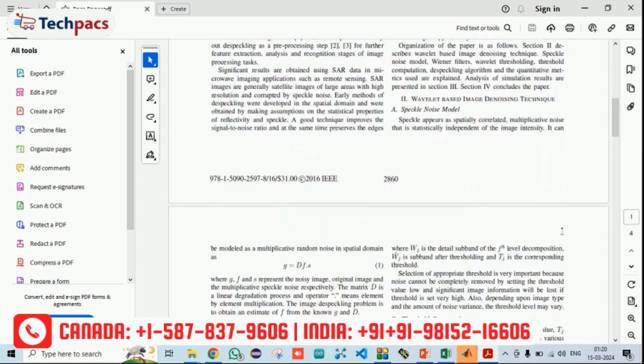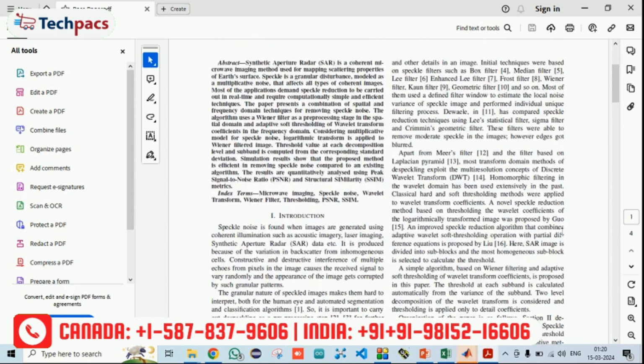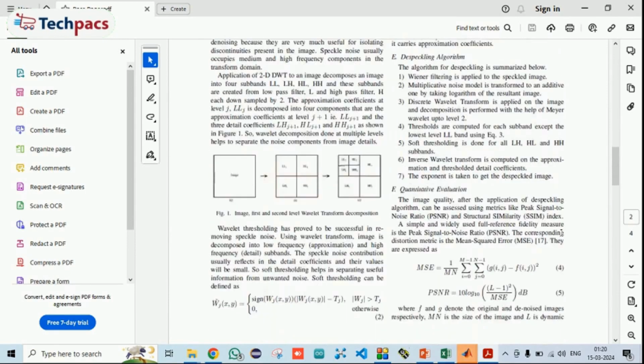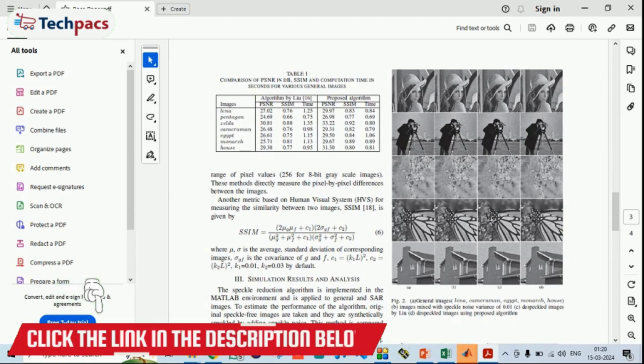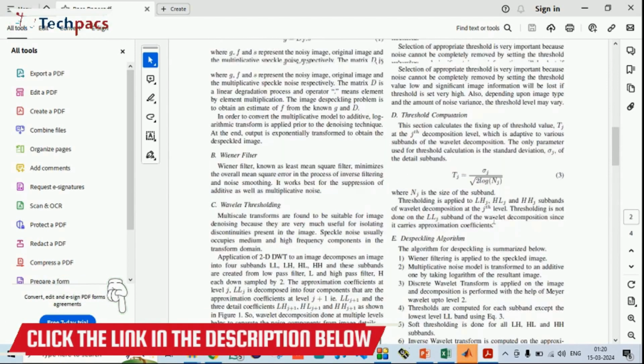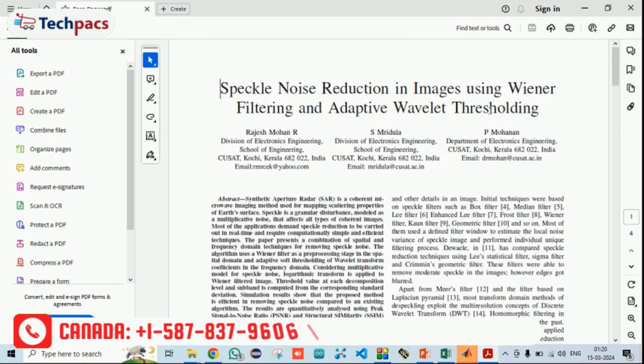But what we have identified is that these methods are successful only up to an extent when the images vary. Here they have tested it on normal images, but we were developing for medical images, where the challenge is greater. So in order to remove this thresholding concept, we have implemented a digital filter, which will take any input as a signal and helps in reducing the noise.